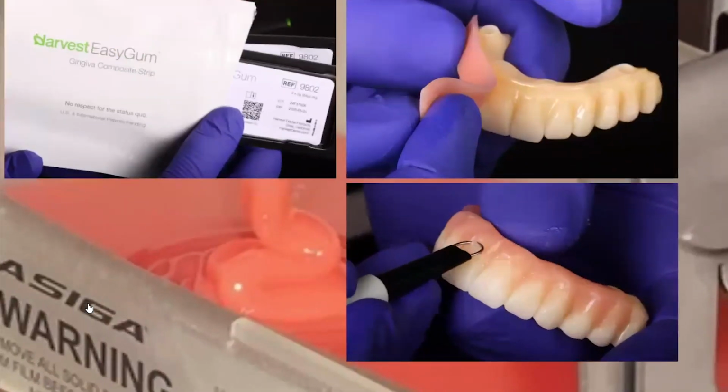The other material that I use for pink, and this is the easy of easy, all right? It's named Easy Gum for a reason, in my opinion. This is literally a stick of pink stuff. Reminds me a little bit of the old Triad material, but it's not near as sticky and it looks better. It's simply, your fingers are your best tool here. Mash it on, push it down in the papillas, and then carve around the gingiva, clean it up, and light cure it. They also have some modifiers, some of those dark pinks and reds and purples that I use underneath this to kind of customize it, maybe have a little deeper look. There's several training videos on the Harvest website about this stuff, and it's taking off. So if you want easy, right, this one is easy.